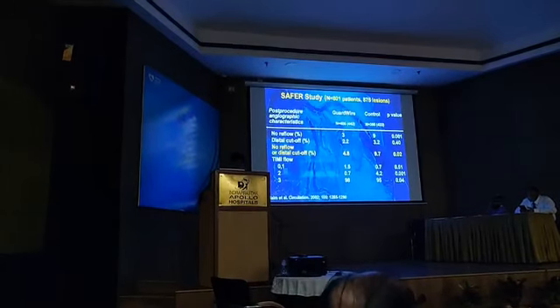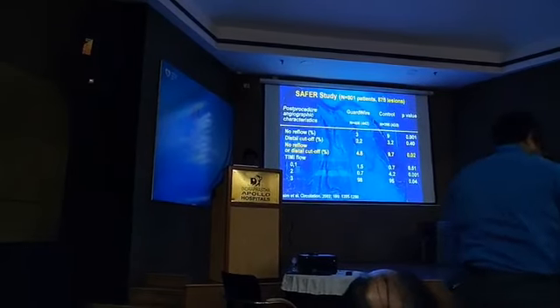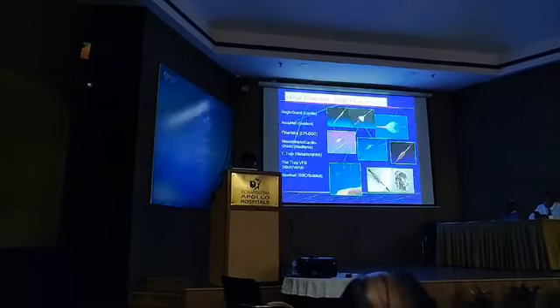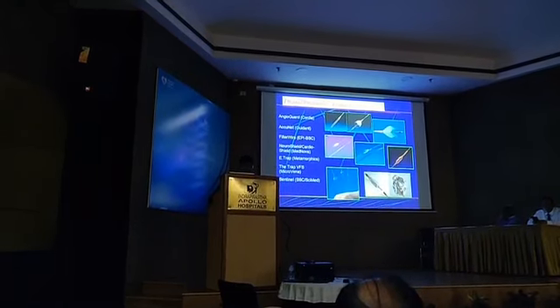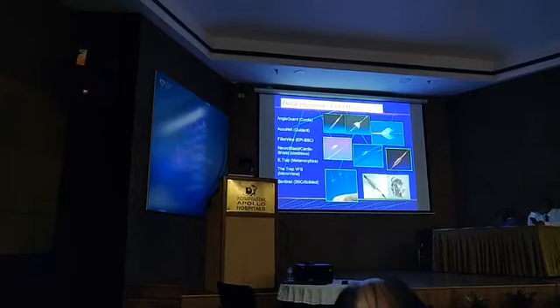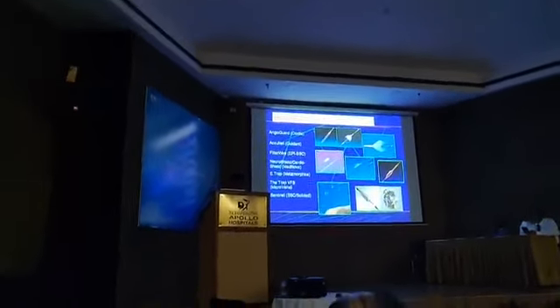The SAFER study has confirmed that GuardWire versus control showed less MACE and less no reflow, and this is statistically significant if you use distal protection devices. The second type of distal protection device, after the balloon inflation, is the filter device, where you put a filter beyond the lesion, and then you perform the angioplasty.